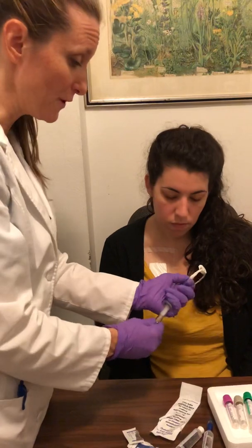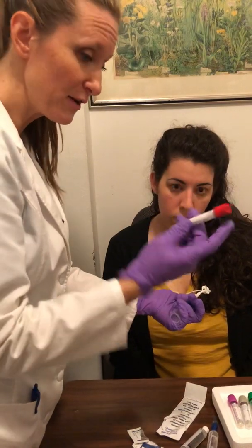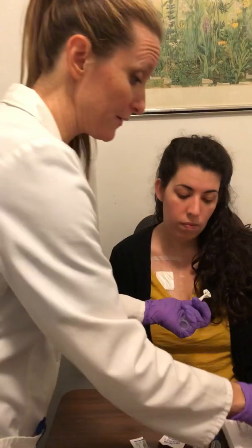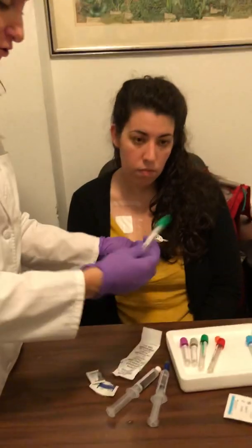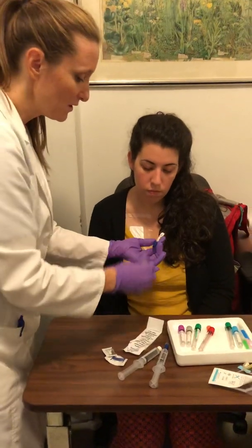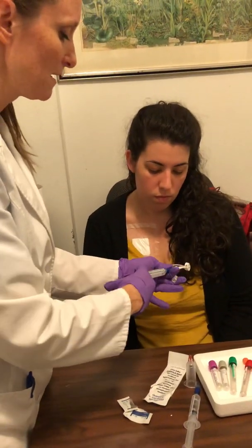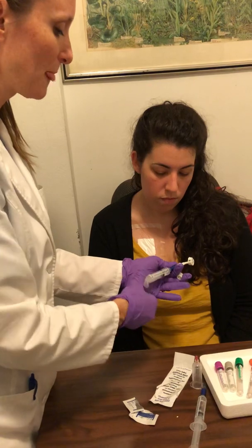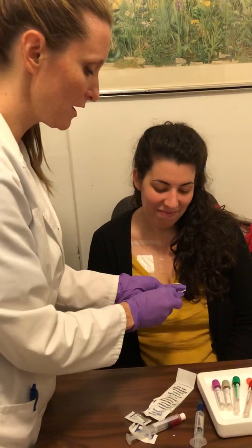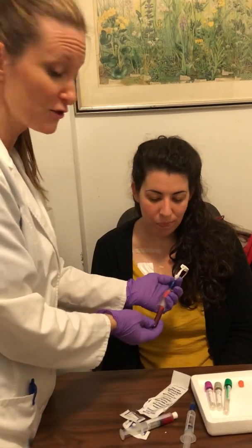We'll use our waste tube to draw out the heparin that's in the tube. This is actually good that this is happening — it's not flowing even though my clamp is open. There are two reasons: one, there's no vacuum in my tube, or two, there's a little flap of fibrin at the end of the catheter preventing it from drawing. I'll try the extra tube to confirm — it's not the vacuum. So remove this, do a saline flush: connect, push-pull — there's your blood.